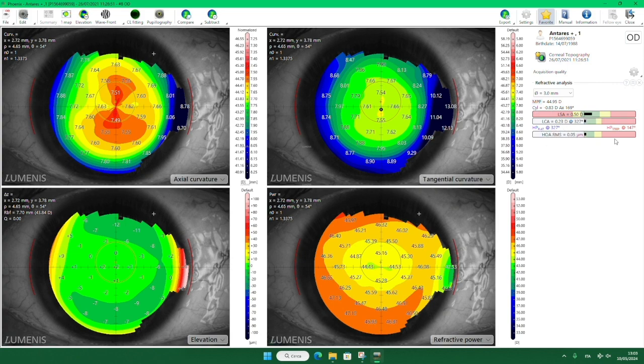So the first one is the longitudinal spherical aberration, expressed in this case in diopters. But you can also have the longitudinal chromatic aberration, and you can get information in terms of power, or, for example, Zernike information. In this case it is the root mean square of aberration. Also, this is possible for higher order aberrations, and once again you can select the information in terms of Zernike polynomials, and so you have the microns of the root mean square.